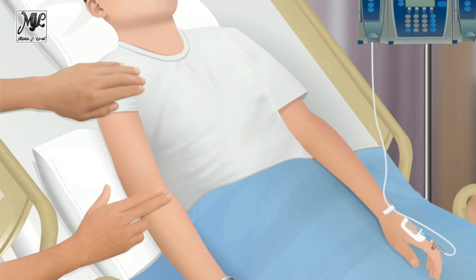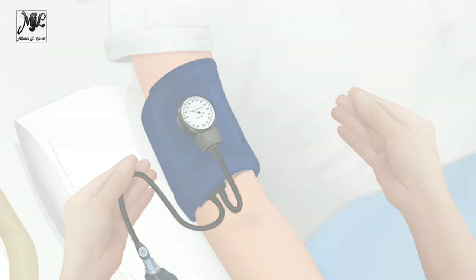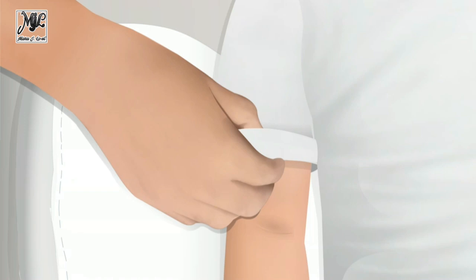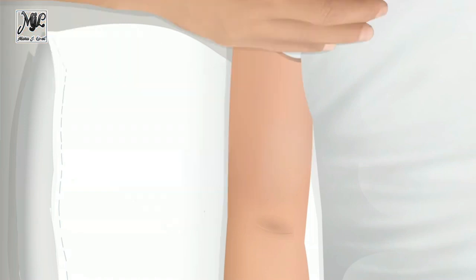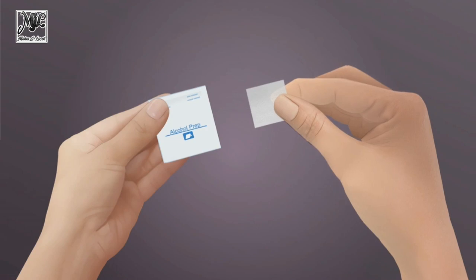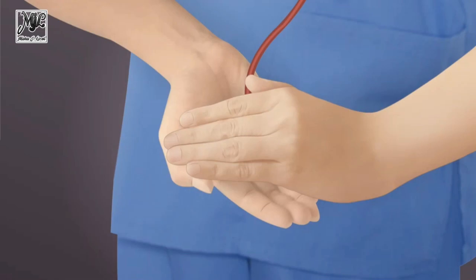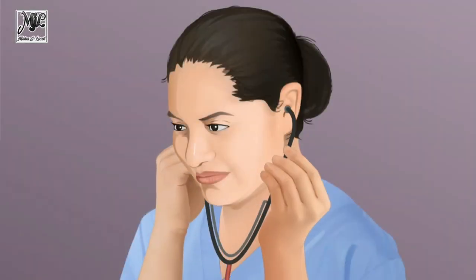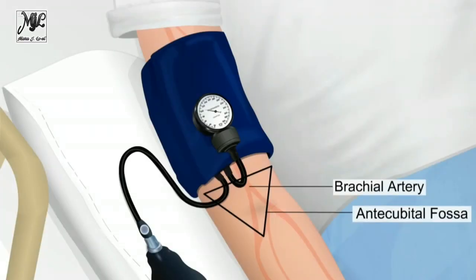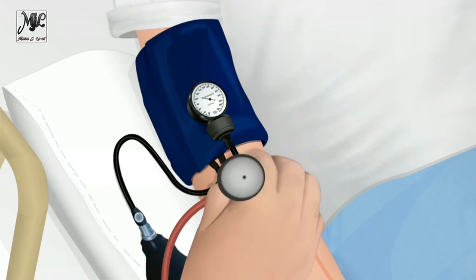To obtain a blood pressure value using auscultation, palpate the brachial artery and place the cuff so the midline of the bladder is over the arterial pulsation. Wrap and secure the cuff snugly around the bare upper arm; remove clothing with sleeves, as rolling up a sleeve may cause a tourniquet effect. Clean and warm the bell and diaphragm of the stethoscope, and place the ear pieces angled forward. Gently place the bell of the stethoscope over the brachial artery pulsation just above the antecubital fossa but below the lower edge of the cuff.